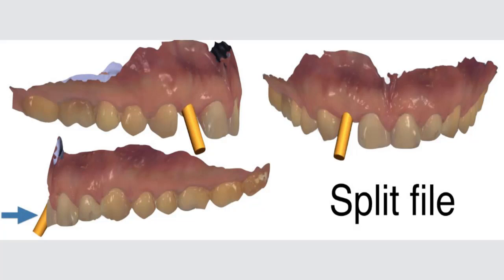Well, I wouldn't fenestrate too much and trust in a lot of bone grafting. We are facing a time where bone grafting is giving us such inconsistent data, maybe in my hands, but I've been seeing some issues when one fenestrates too much and then relies on bone grafting. But anyways, here is what I have.